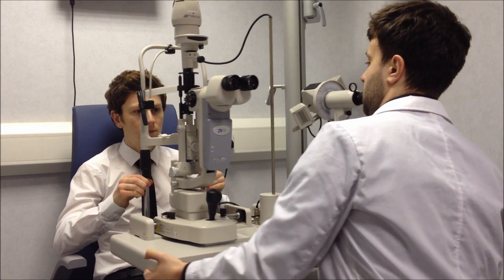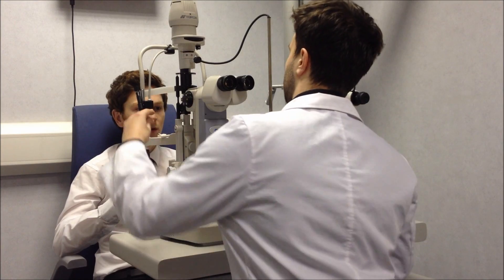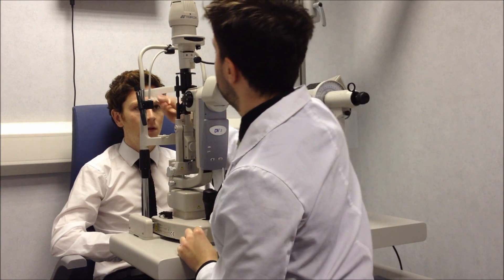What we want to do is just bring the slit lamp round to the patient and then just check the height. Is the height okay for you there? Looks alright. What we'll do is remove one of these just so it looks clean, and then we'll give it a wipe down.